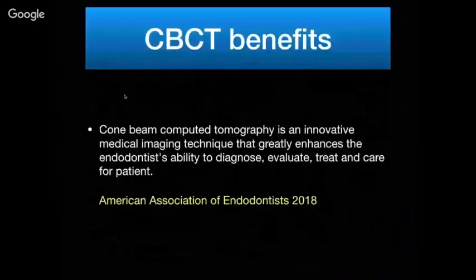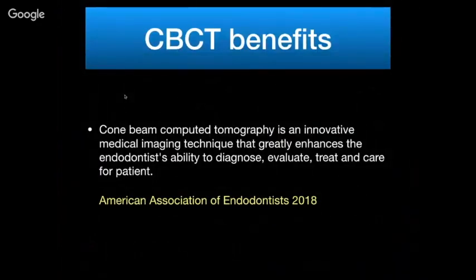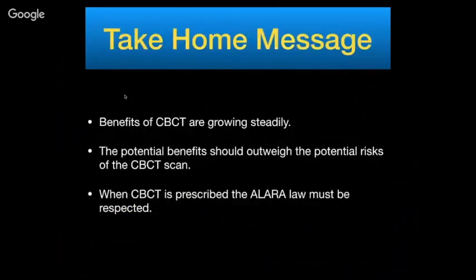So what are the benefits of the CBCT? And just to mention a citation from the American Association of Endodontists, in many cases the CBCT could help in diagnosing extremely difficult cases where we had a vertical fracture, for example, resorption, the extent of the resorption, to preview the surgery. And we could conclude, as a take-home message, that the benefits of the CBCT are growing steadily. Those potential benefits should outweigh the potential risk of the CBCT.